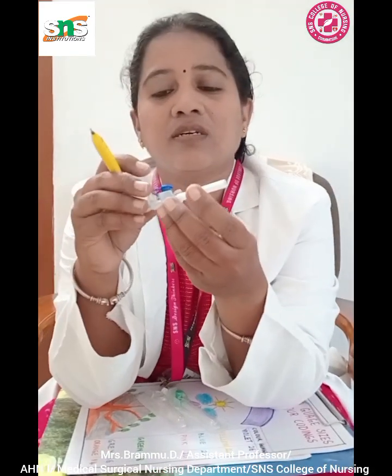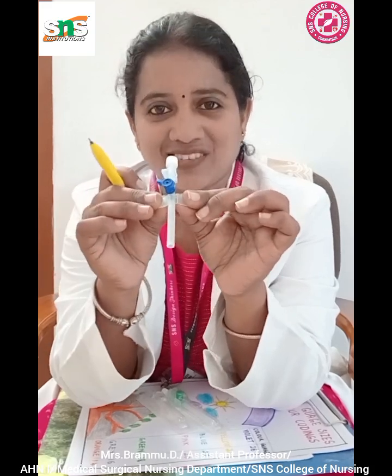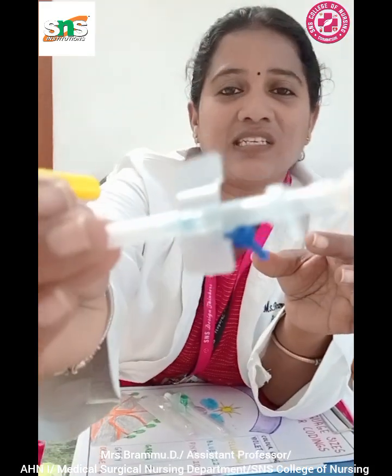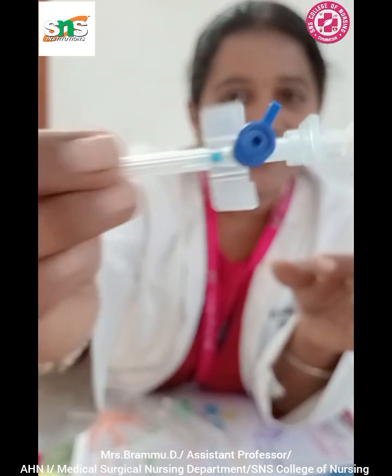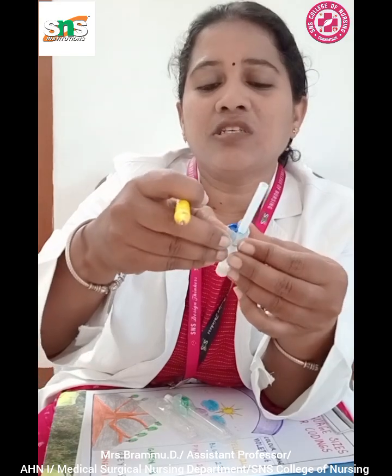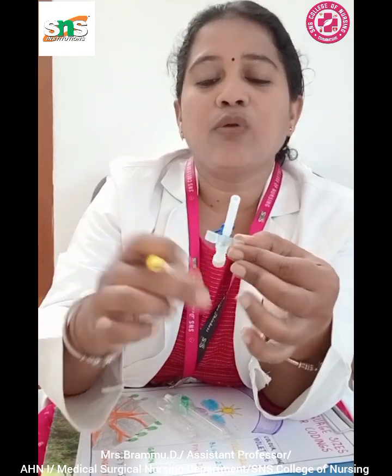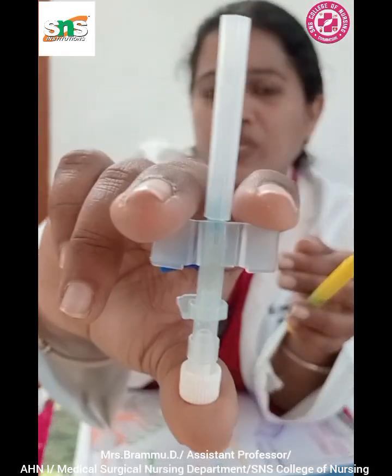We'll go to the next part of the IV cannula, which is the wings. Oh my god, what are the wings? Yes, the wings are nothing but, you can see, like aeroplane wings or a bird's wing. When it comes in the IV set, you can see that it is all folded upwards, right? But during insertion, we nurses unfold it and turn it into a wing, right? Are you clear now? We will be turning it into a wing, and this is how you handle the IV cannula.